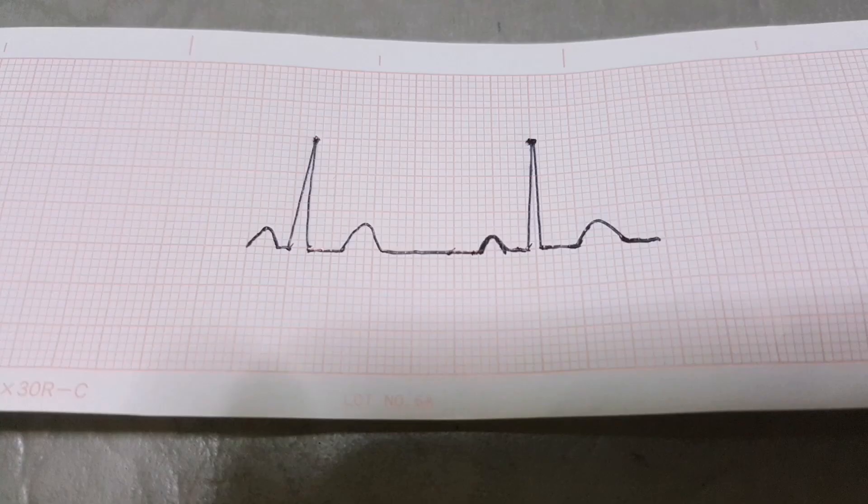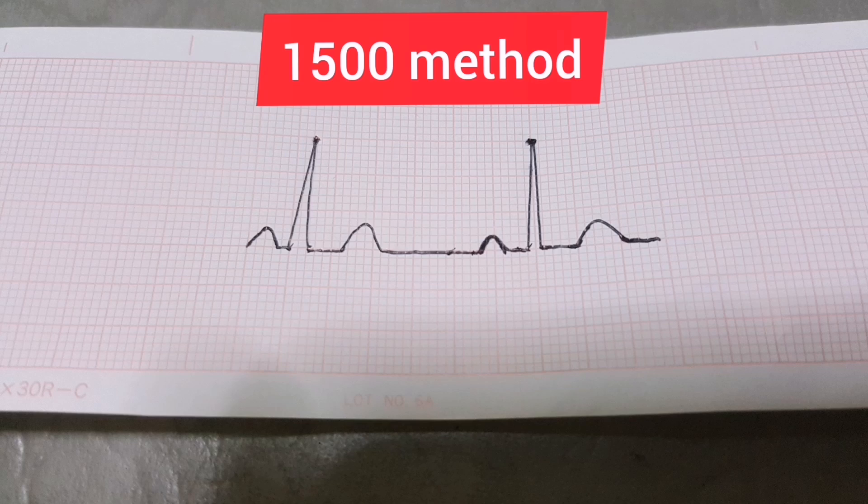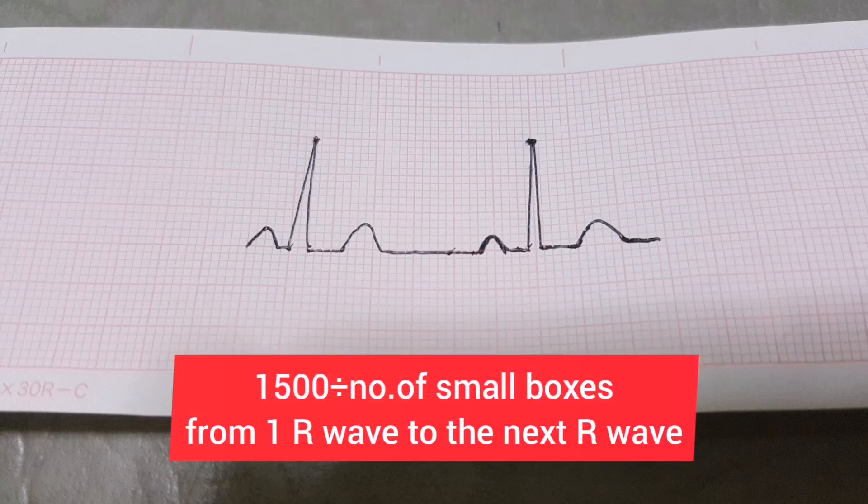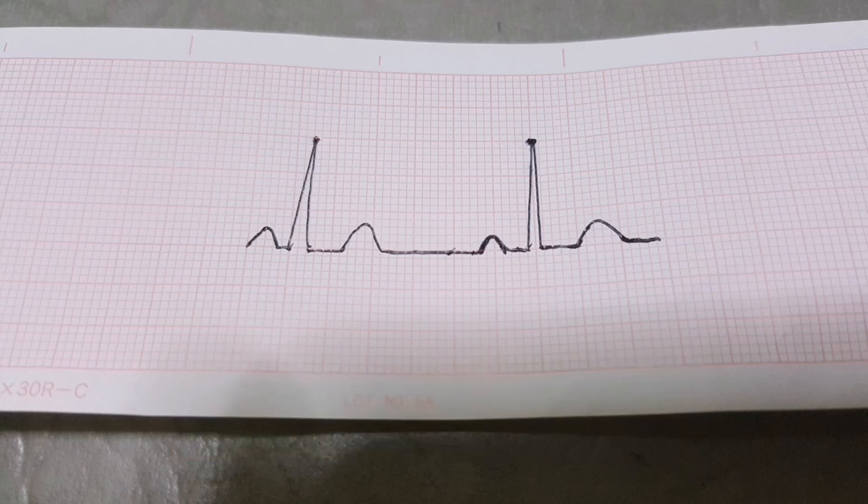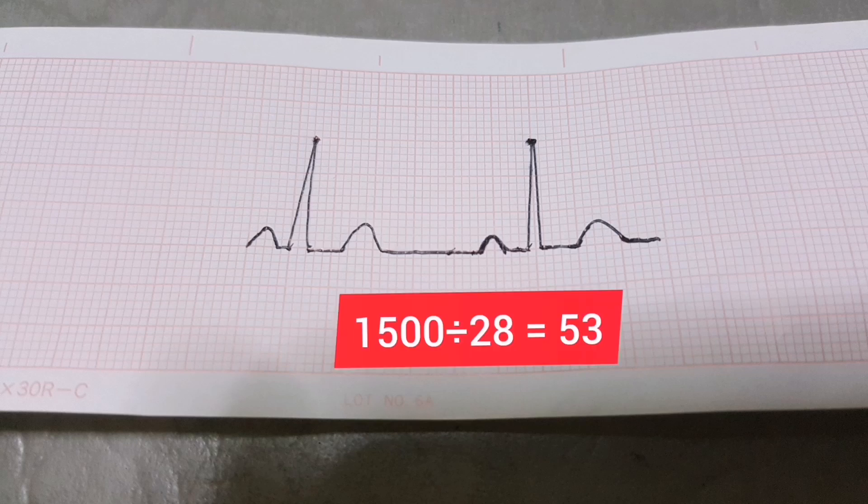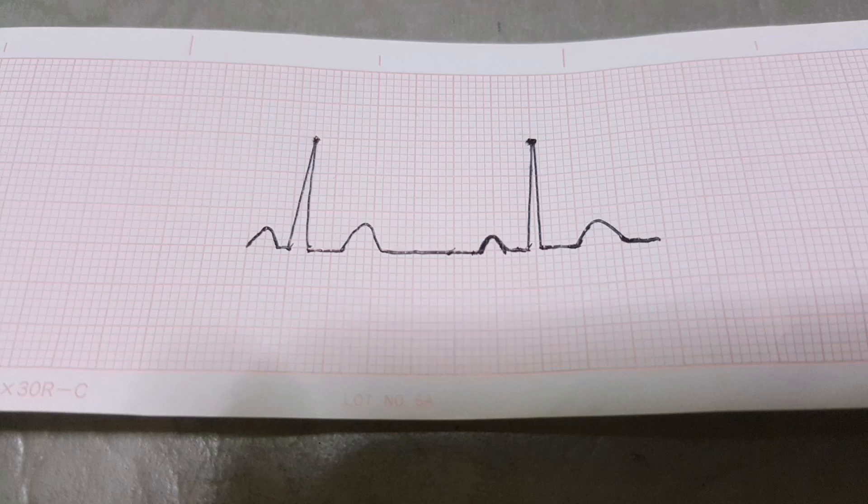The last method is the 1,500 method. It is the most accurate of all. You just have to count the number of small boxes from one R-wave horizontally to another R-wave. In this example, there are 28 boxes from one R-wave to the next R-wave. Therefore, 1,500 divided by 28 is equal to 56, and the tracing is sinus bradycardia.